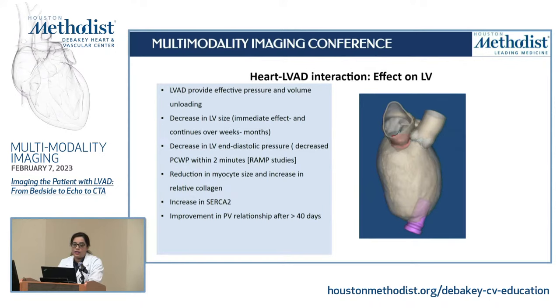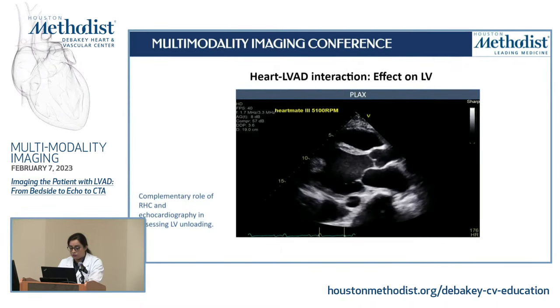So basically, why we're asking for an echo when we increase the speed, and why we're asking for an echo when we see them in clinic, is because of these reasons. And you will see that there is a decrement in LV end-diastolic pressure, there is improvement in overall hemodynamics. Again, like I said, full disclosure, we do not use echocardiography alone.